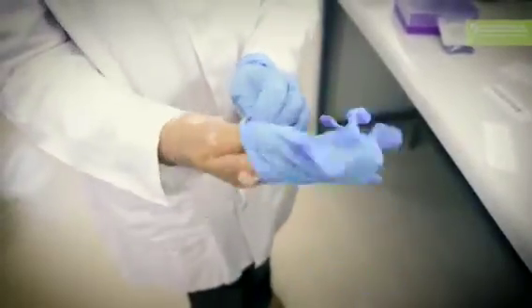So to start the test, you first ask the patient which hand they use, and you use the non-dominant hand. So for example, if the person is right-handed, you always take the test from the left hand. Once you've selected the non-dominant hand, you select the finger. You can use either the middle finger, the index finger, or the ring finger.